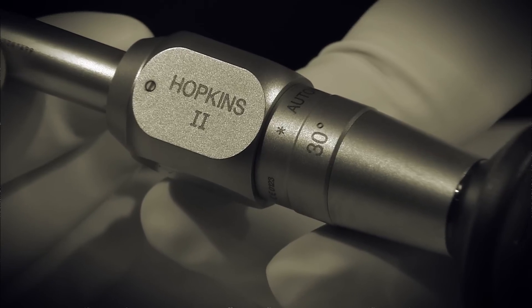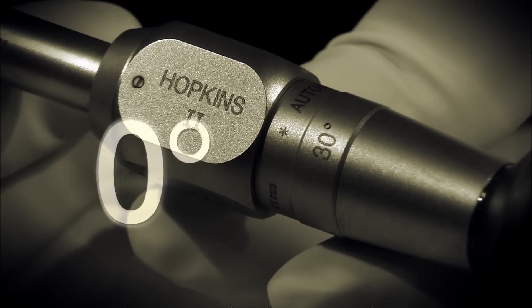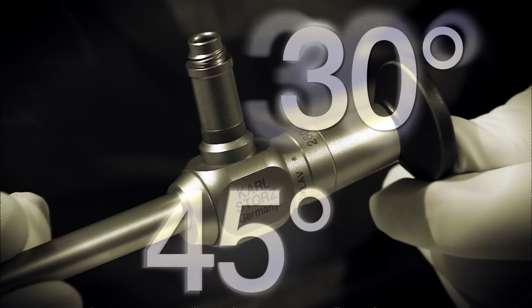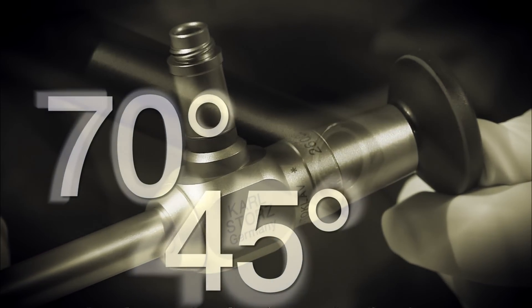In the past, the viewing direction was predetermined as 0, 30, 45, 70, or 120 degrees by the selection of the telescope.